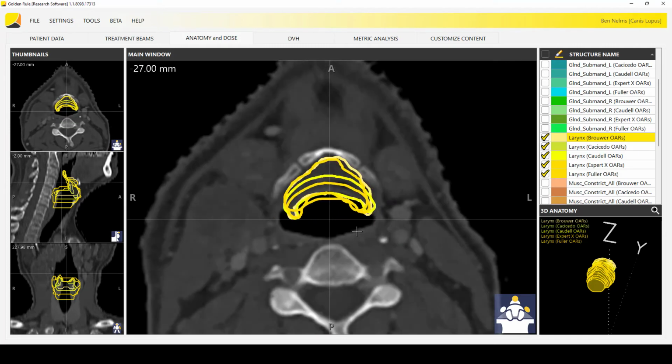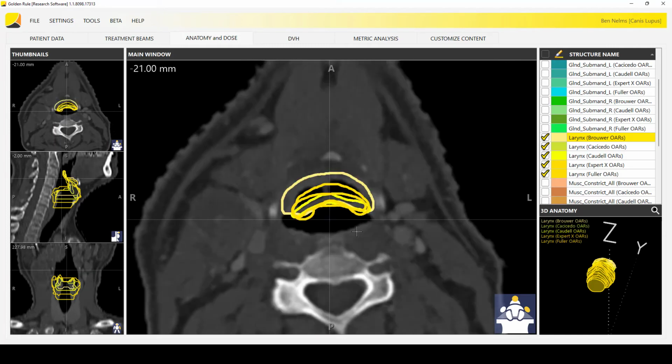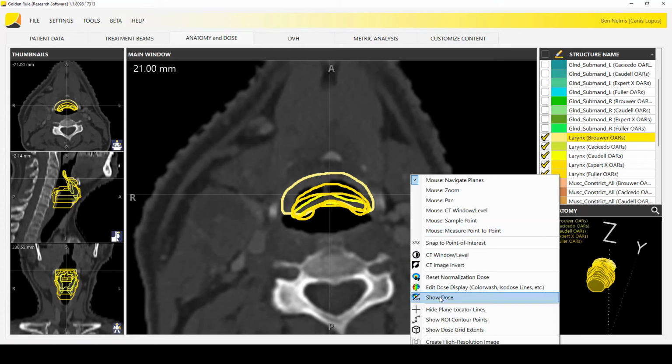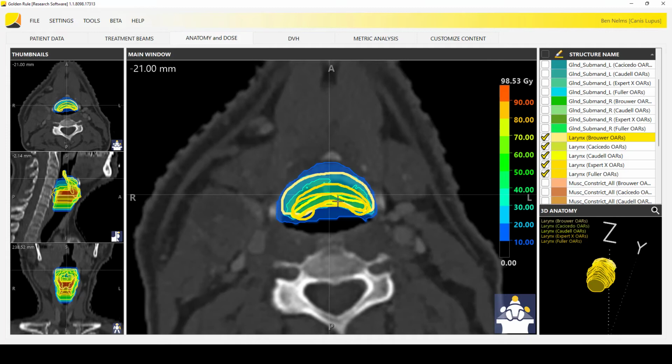So these are different techniques. And so there's a question here. Did people read the instructions? Were the instructions specific enough? Or are the instructions open to interpretation? And that's a pretty good question, because that's what happens in the real world. So if people are comparing DVHs for the larynx, but they're drawing it with vastly different strategies, then we've not got the best designed experiment, do we?